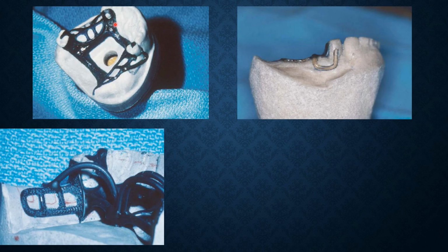So then the spruing of the framework, guys. Now you have this wax pattern, and you can see that the spruing is done. You have to create a hole here for the investment ring. You do spruing by wax, and the material is seated in the middle, so nothing moves and everything is in place. So all the attachments are intact.